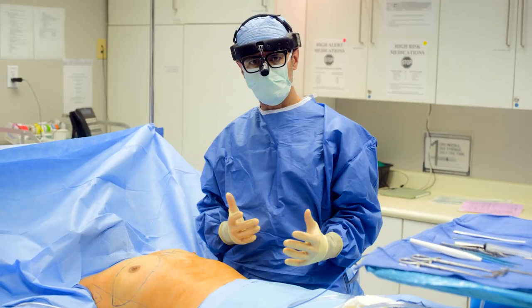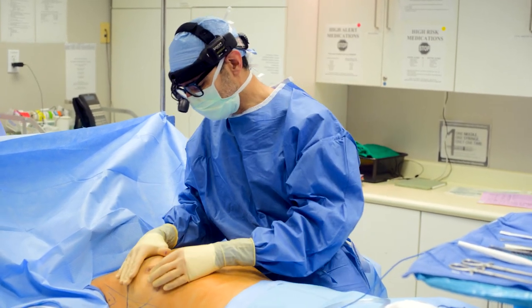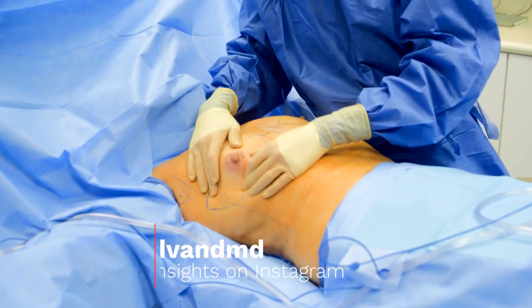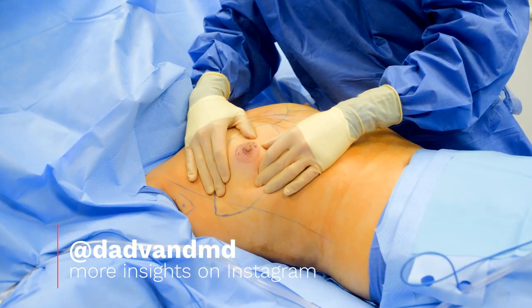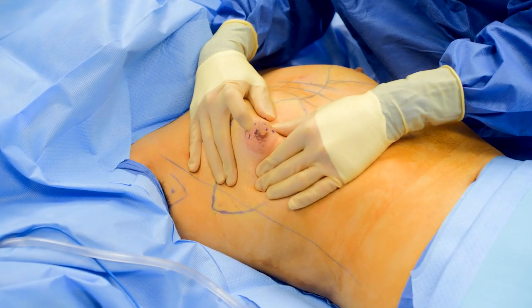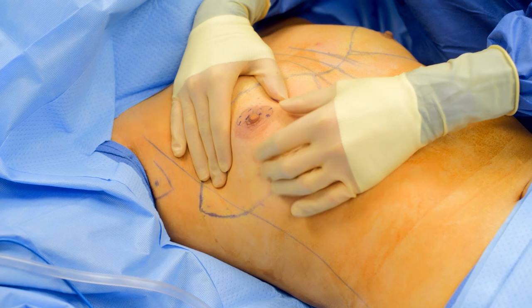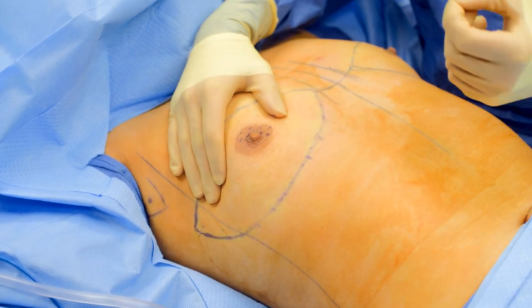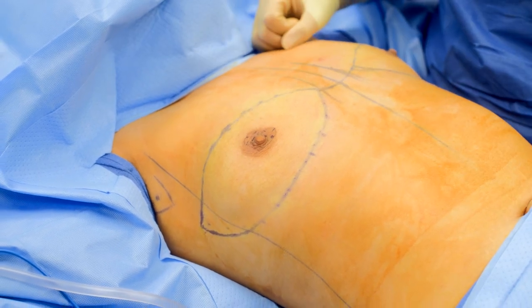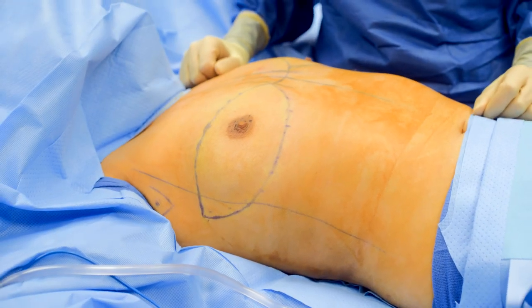Here we are in the operating room about to do this top surgery. What I did in this case was mark out where I'm going to take the areola from. This natural nipple is way too big for the size of areola that I want to take. So I'm going to take the areola separately and then take a piece of each nipple to use as a separate nipple graft. I'll show you what that means towards the end of the case when I'm actually doing the nipple and areola grafts.